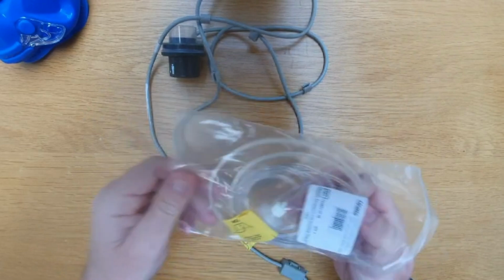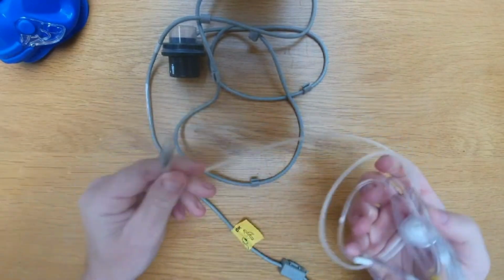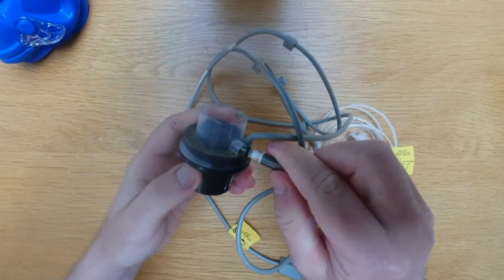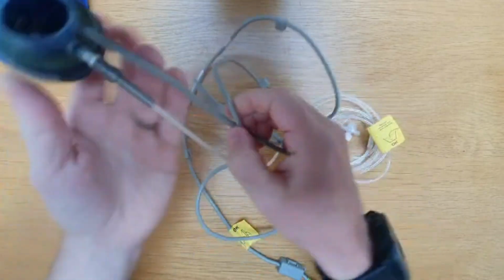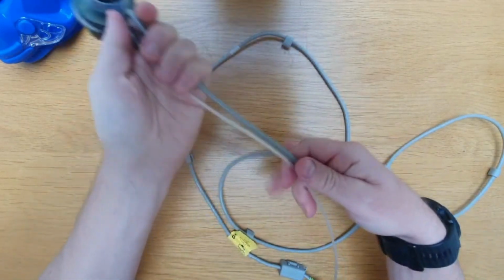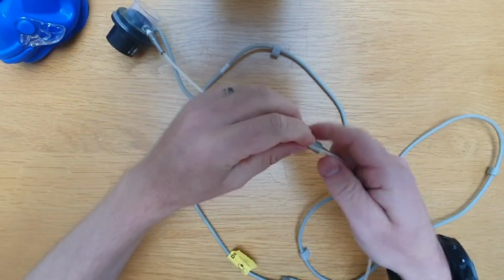Open the new PermaPure and connect the black connector to the flow meter head. Begin reconnecting the PermaPure tube to the flow meter cable.